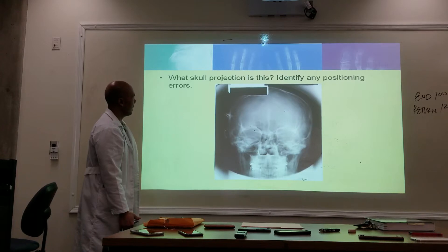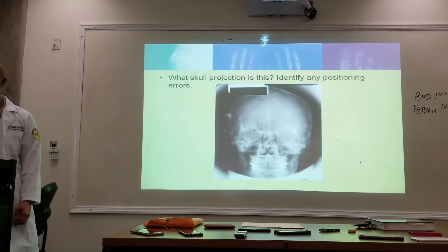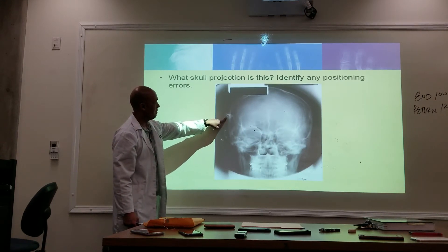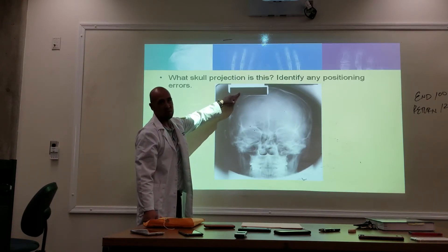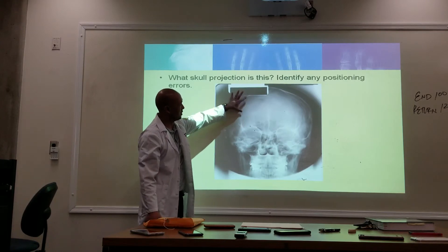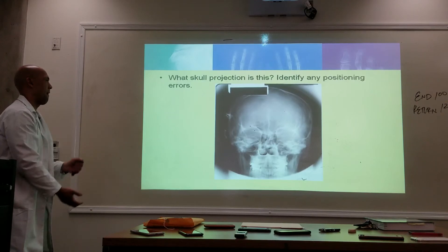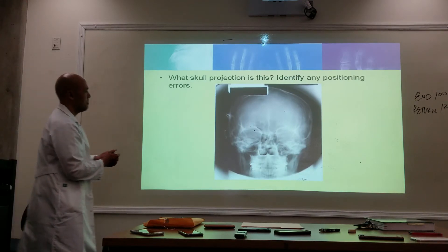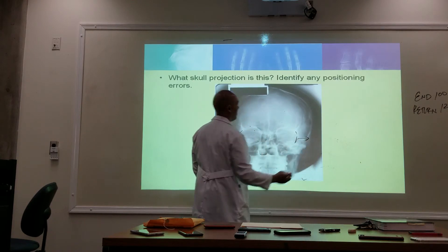What are the errors here? There are quite a few. The marker is on the anatomy, and this is before your time — we also have the blocker in the middle of the anatomy, so this would warrant a repeat. AP or PA? We're looking at the outer margin — PA.